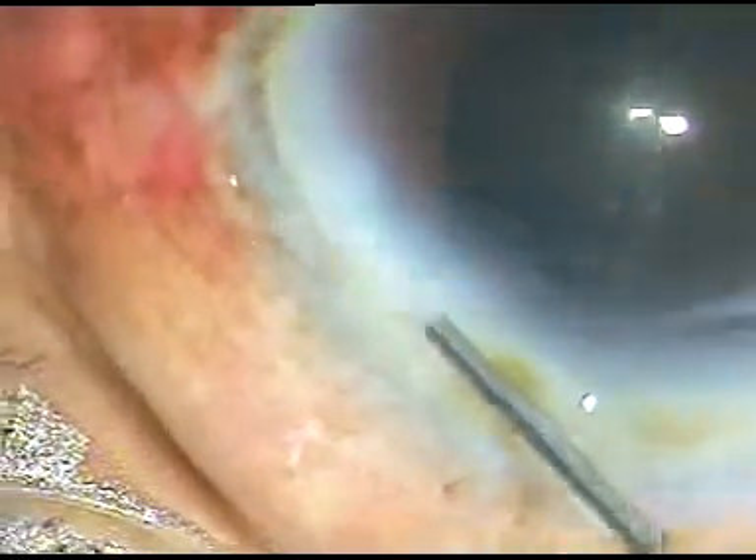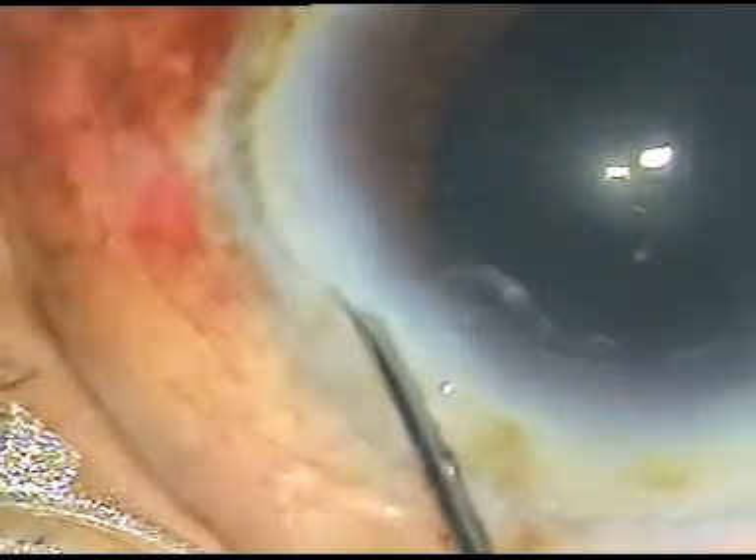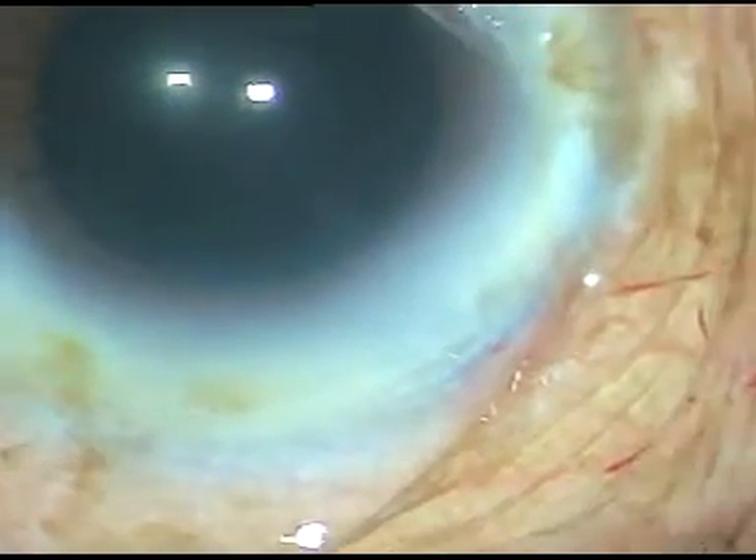Dear colleagues, if you do just one case of hard cataract with this technique, you will be so confident that you will not try to do some other procedure in hard cataract. Thank you very much.